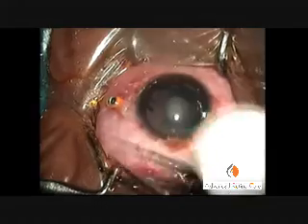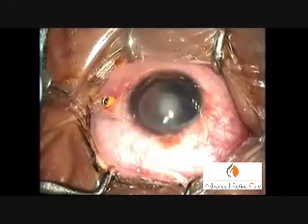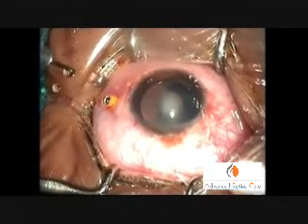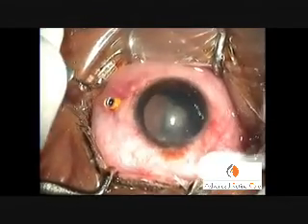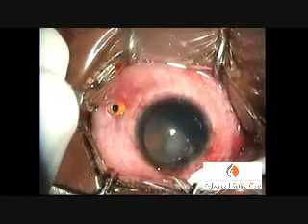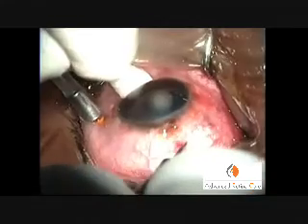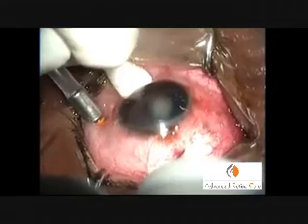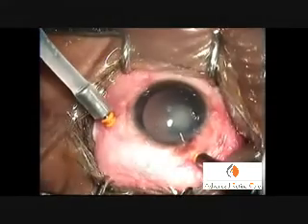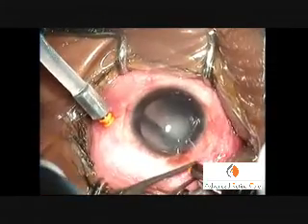A trocar is inserted 3.5 mm from the limbus in this phacic eye, in the inferotemporal quadrant. An infusion cannula is now placed and checked. Another trocar is inserted in a superior quadrant.